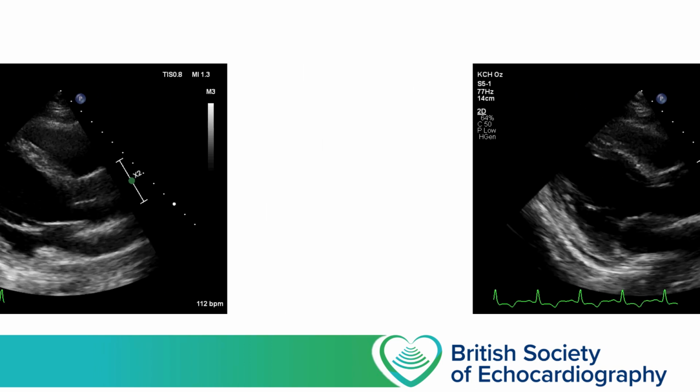There's no single correct way of setting up your system here, and the decisions you make about trading line density and frame rate will be dictated by what it is that you're trying to demonstrate.